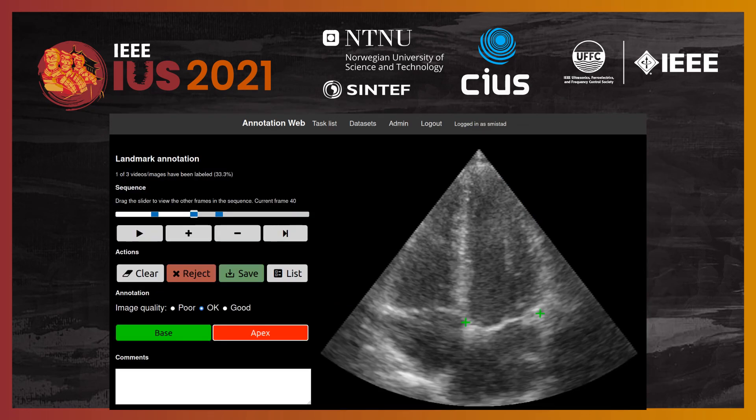And finally, here is the landmark annotation tool, which can be used to annotate specific landmark points.